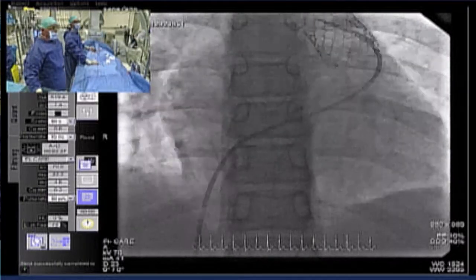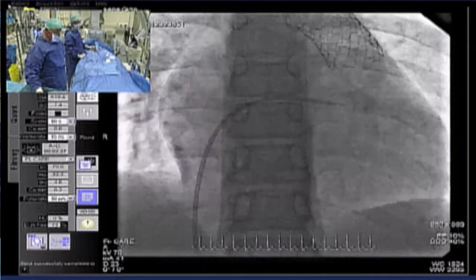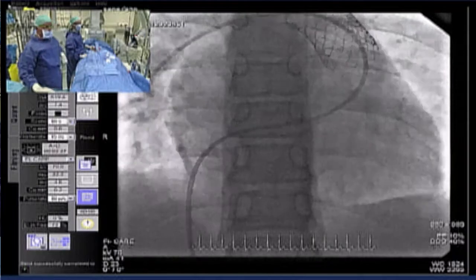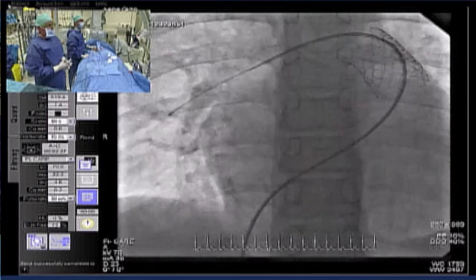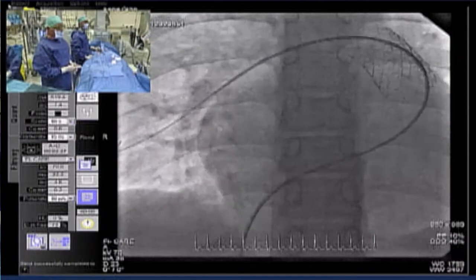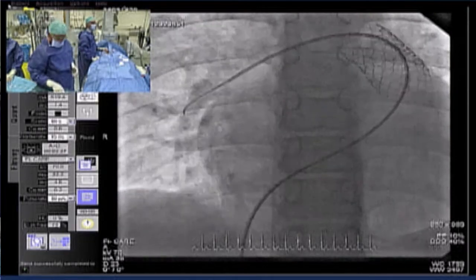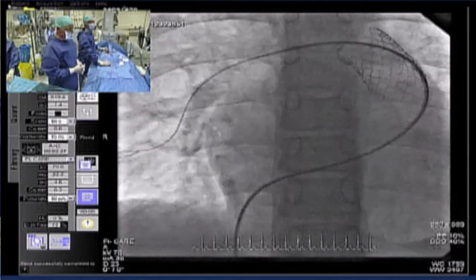As you can expect, the worst thing you can do is enter the stent by a side hole. So using this balloon tip technique has two advantages. First of all, you miss the tricuspid valve or the chordae. And second, you enter the main entrance of the stent and not a side entrance. Then we're looking for a vessel, a place as distal as possible, as you know that putting in the valve can involve some fiddling around with the valve.